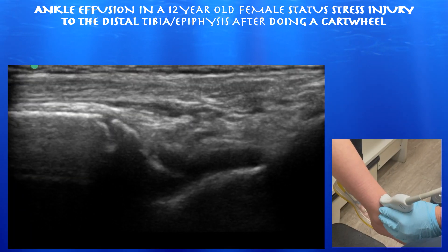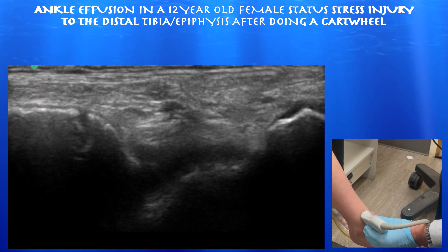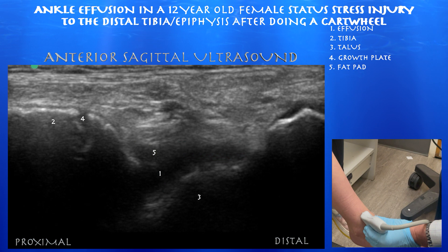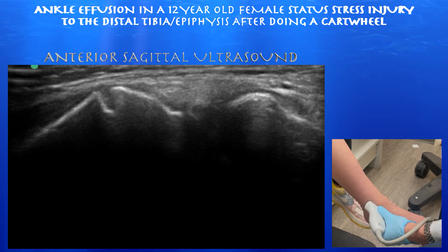Here we're looking at the ankle joint in a sagittal view. You can appreciate a fairly sizable effusion here. You can also appreciate the growth plate in this 12-year-old female. You can see how the fat pad is pushed upwards from the effusion.